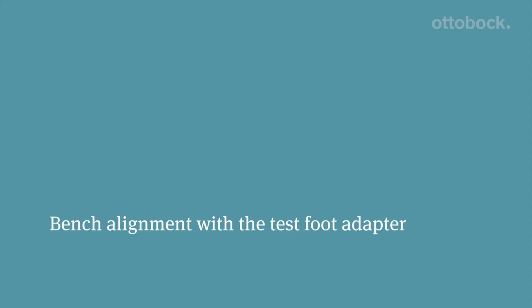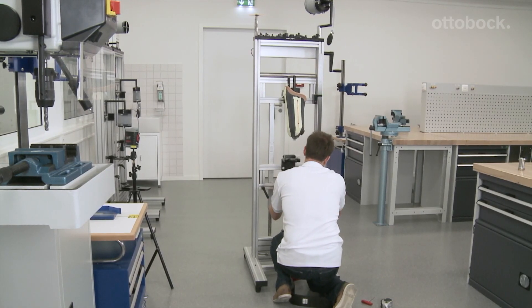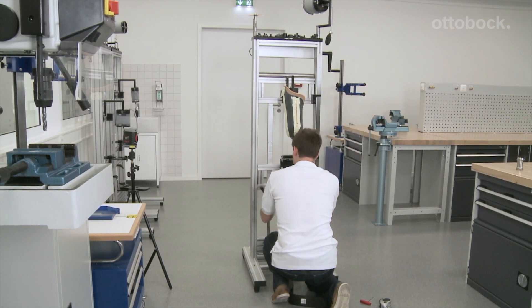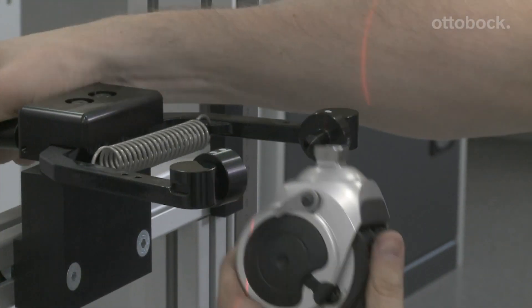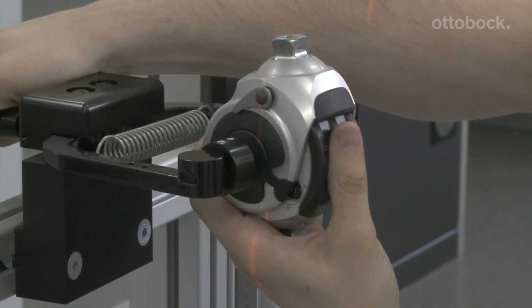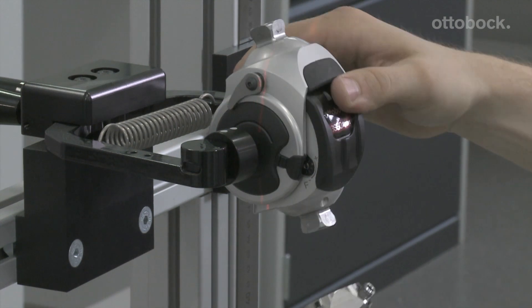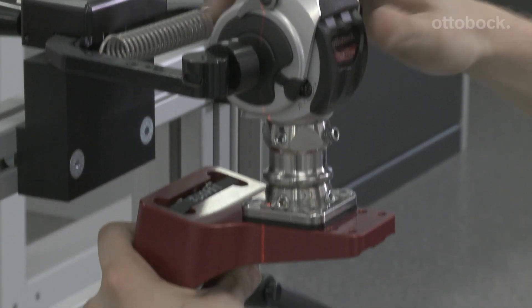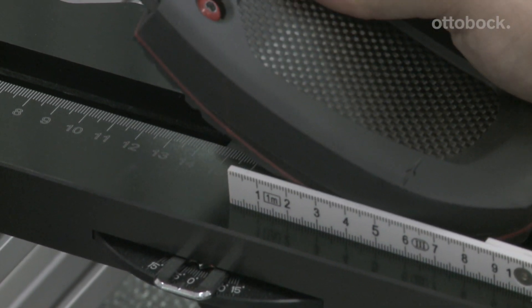For the alignment of the prosthesis, it is advisable to use and combine components from the manufacturer exclusively. At the beginning, it is necessary to check whether the joint is locked with the small lever on the outside. The positioning of the alignment reference point to the alignment reference line is 0 mm at the knee. The knee joint is aligned with external rotation of up to 5 degrees. The foot is aligned without physiological external rotation.